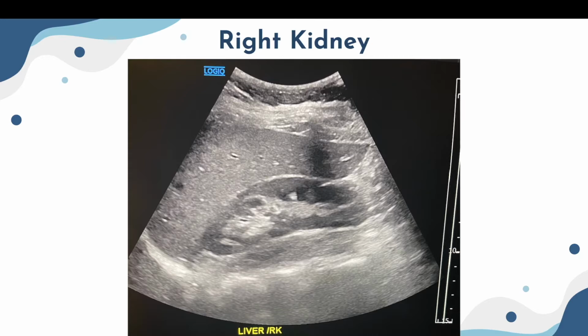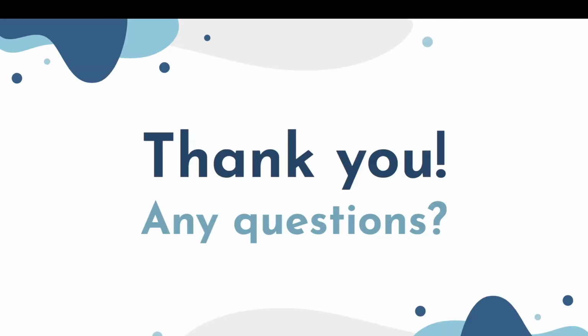Should we start scanning? We can start scanning. Let's do that. One little question. Do you have any insights into the more affordable ones like Butterfly? I do not. I haven't really used them. I work in radiology, so.